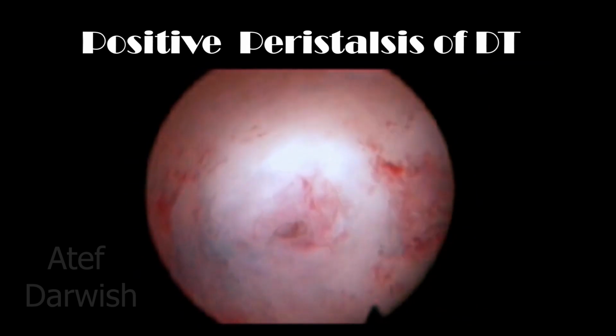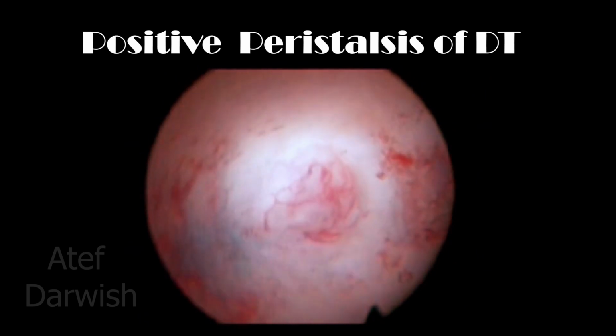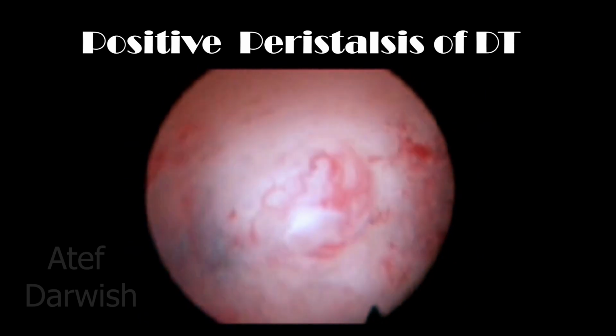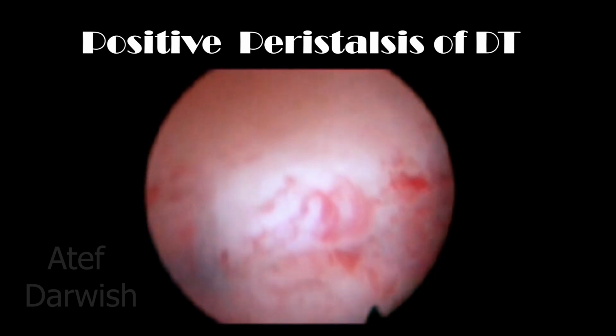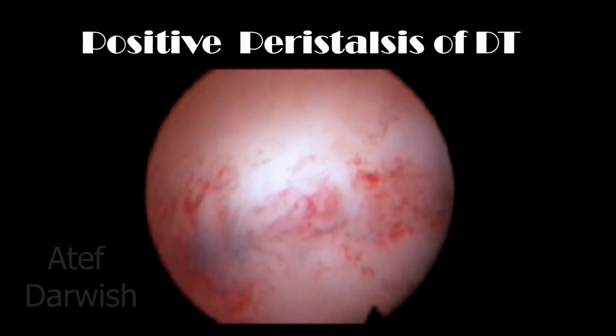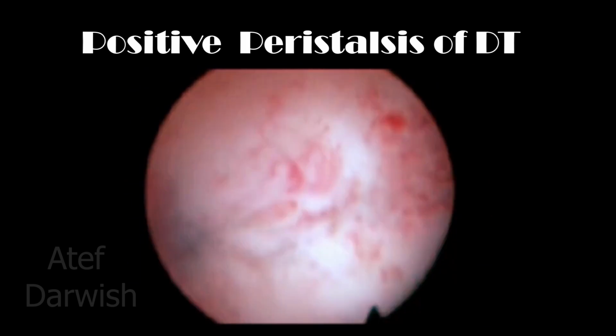Here the polyp is coming out and protruding inside the endometrial cavity, which documents that this case has positive peristalsis, which pushed this polyp into the endometrial cavity.